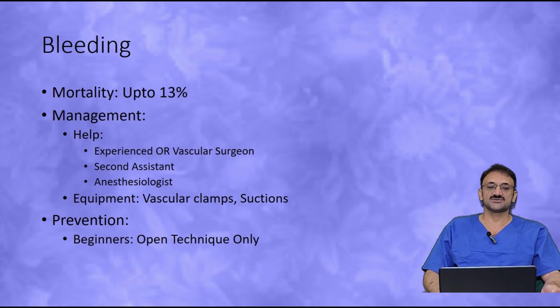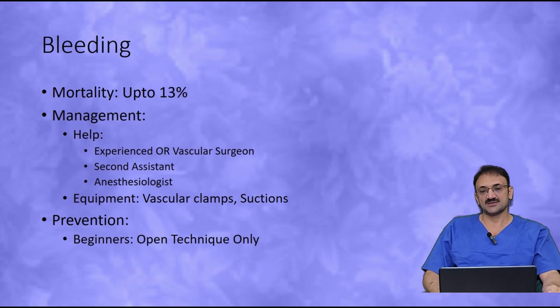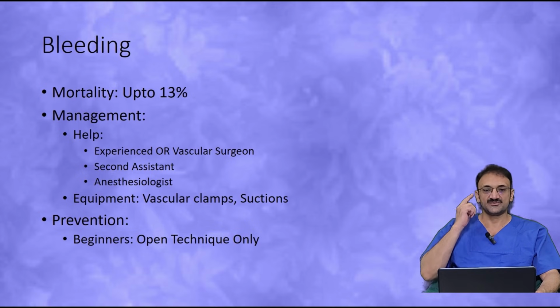Once the first trocar is placed under vision and the pneumoperitoneum is created, you can place a telescope into that port, and this will lead to a visualization of the peritoneum from the inside. Then you can place the other ports under vision in order to prevent complications.